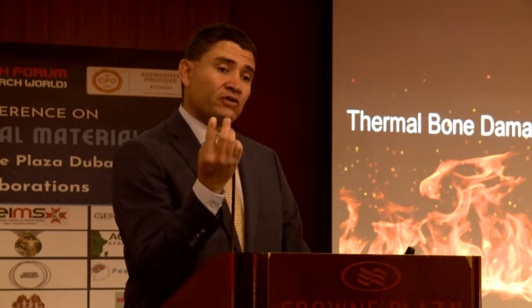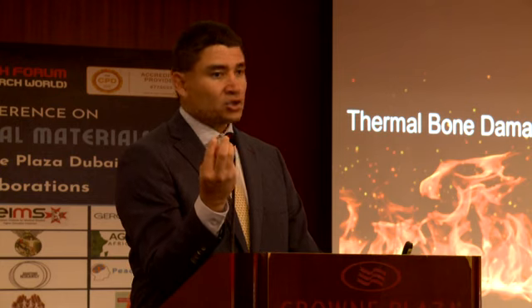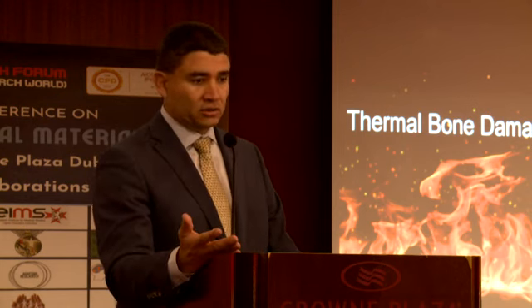Oh, but I use internal irrigation because my manufacturer tells me that this is the best thing that happened to mankind. Well, we tested that and we saw that with internal irrigation, the particles of the bone shavings clog the internal irrigation line, so there's no flow. So this is a gimmick. In vitro, outside, it works. You put it in the bone, it doesn't work anymore. We did in vitro and in vivo studies for that. So don't kid yourself, guys. Use your technology the way it's designed to be used, but use your brain to use that technology, right?